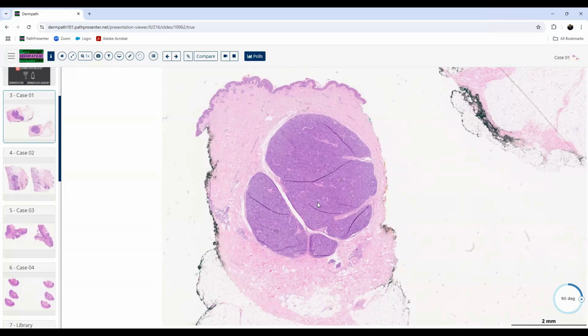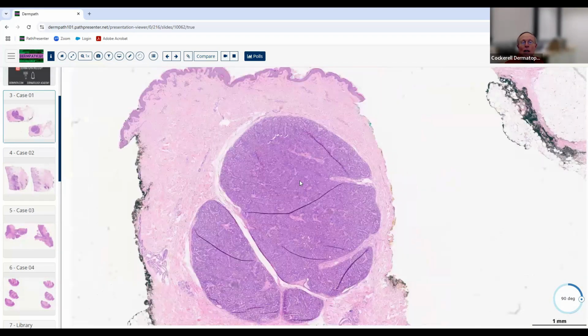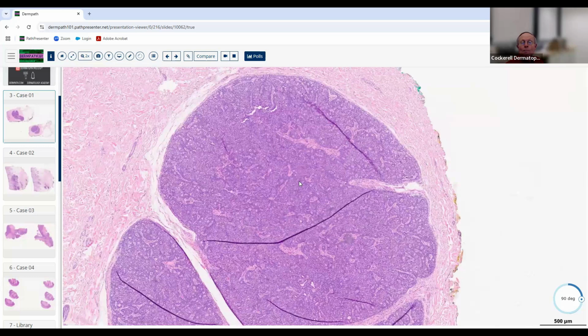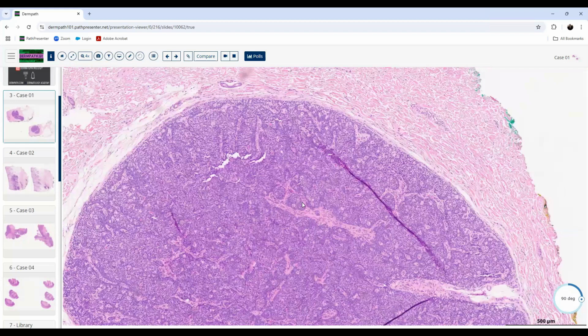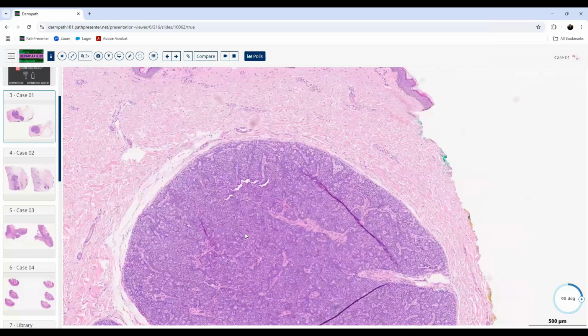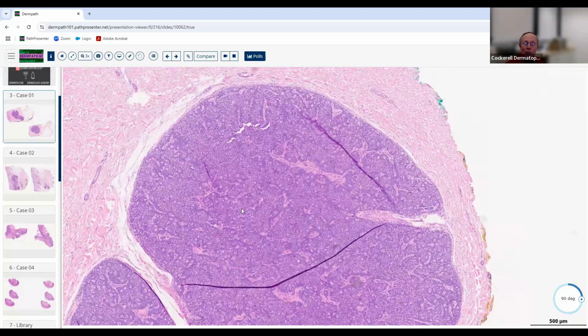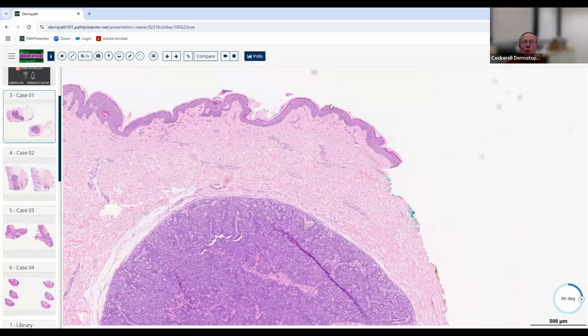And the next thing we do is ask ourselves what kind of differentiation it's exhibiting. So once we've got it into the epithelial category, there's not a ton of different kinds of epithelium that exist in the skin. I was favoring maybe like an adnexal structure. Okay. Now we have several different adnexal structures. So yeah, it's more possibly adnexal. It's not just stratified squamous epithelium we're looking at here.